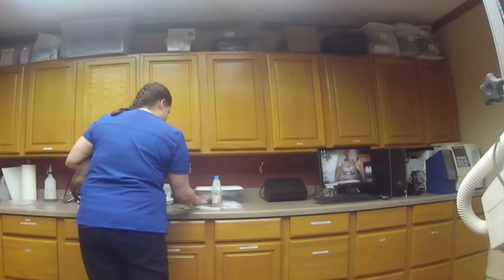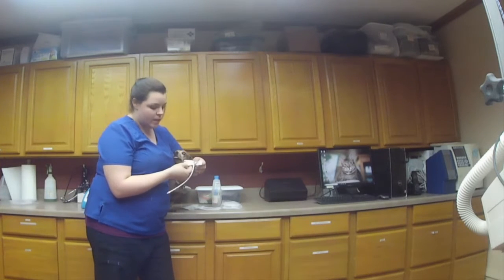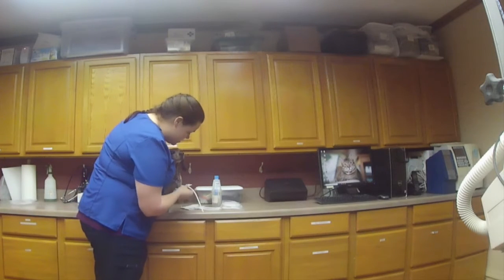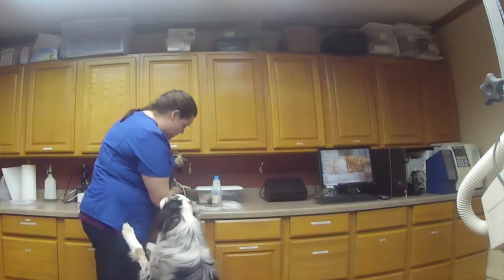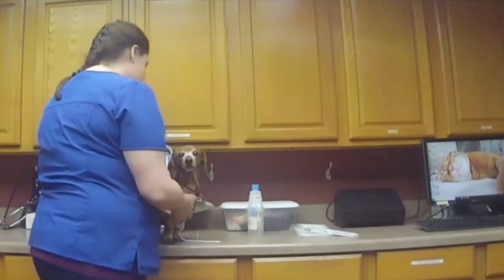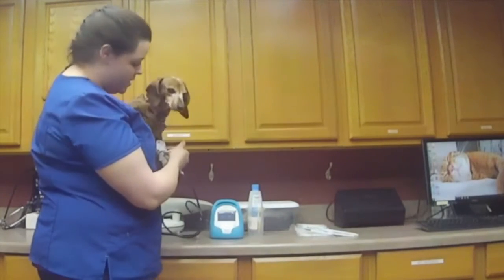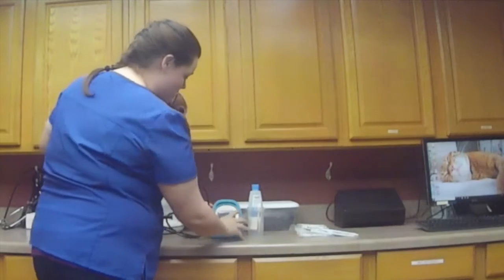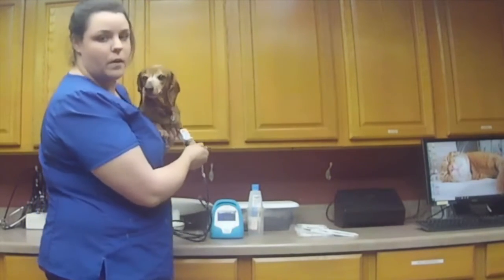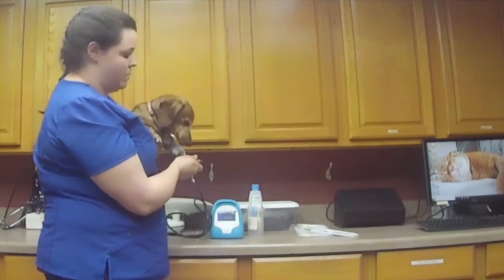here, let's see. There is a spot that says artery. This is where your main vein is in the leg, and it needs to be on that piece. Not too tight, but not too loose. Okay, you'll want to hold your patient still. You've got your monitor on, and you will hit start, and you hold out their paw, and it will test their, or take their blood pressure.